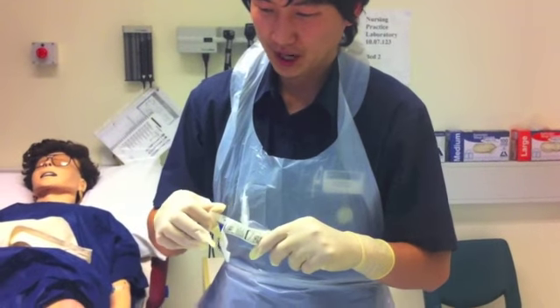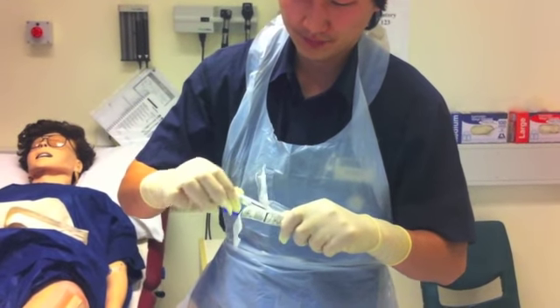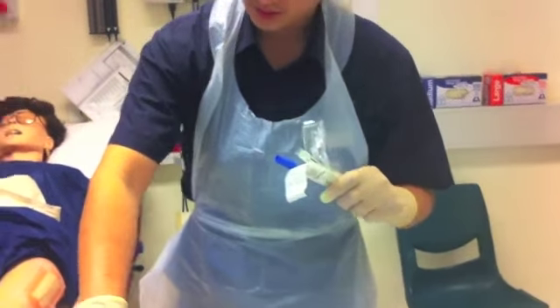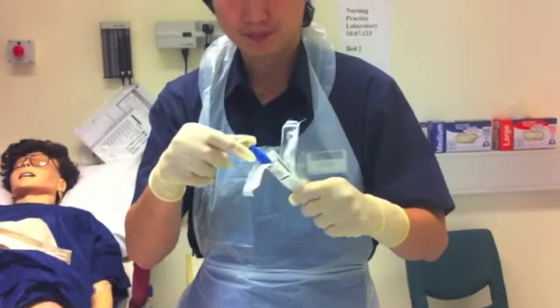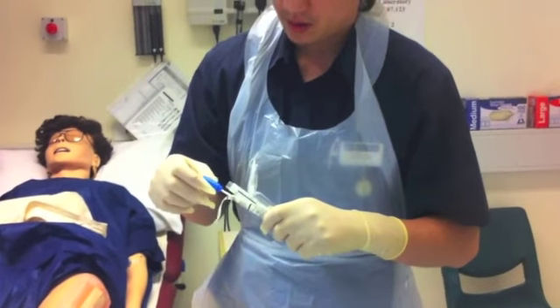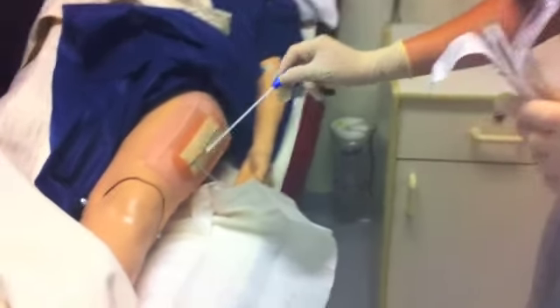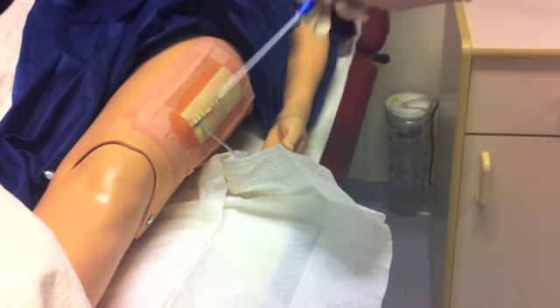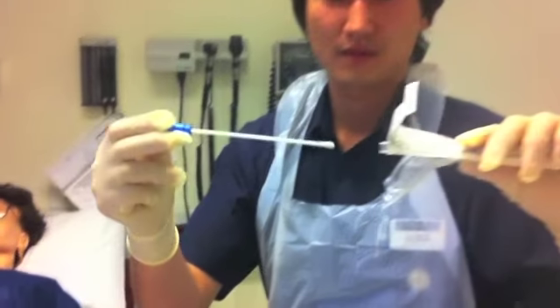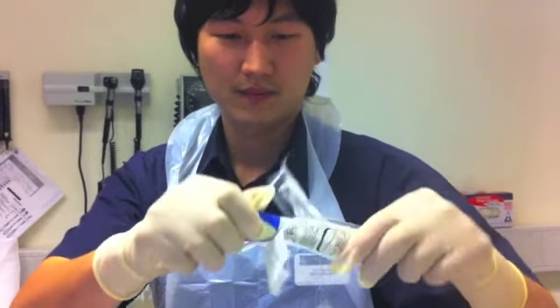Firstly, I remove the cap from the top of the swab container while ensuring I don't touch the top of the swab. Then carefully take a swab of the drain site, just gently rotating, and put it in the container.